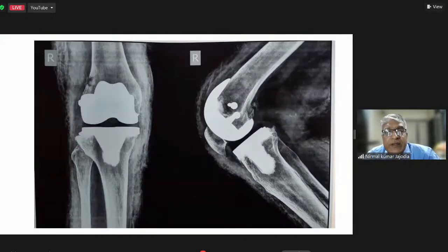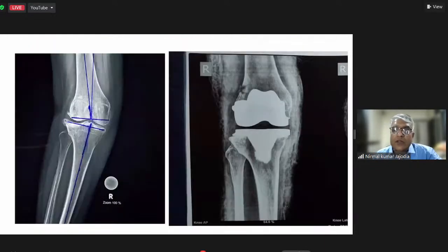So this is the post-op X-ray where we can see that the fragment has slid slightly distally and more significantly posteriorly. The extra amount of bone has been trimmed and we could still manage with a primary cruciate retaining knee without any constraint, and a well-balanced knee with a good function. So that was the deformity, that is the balance.